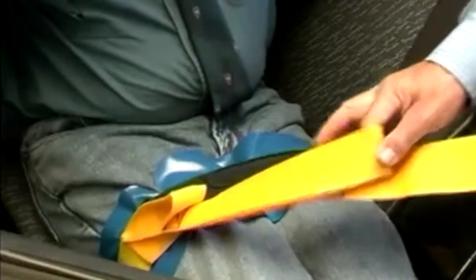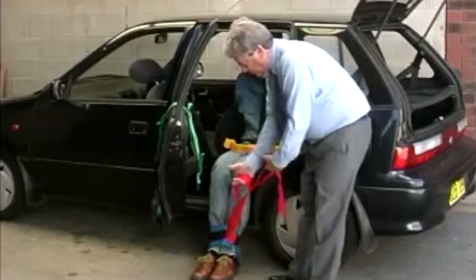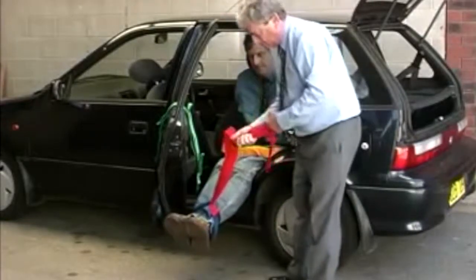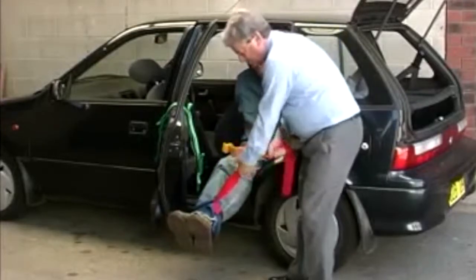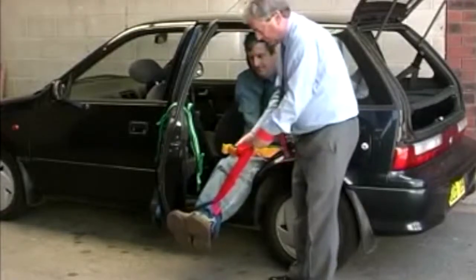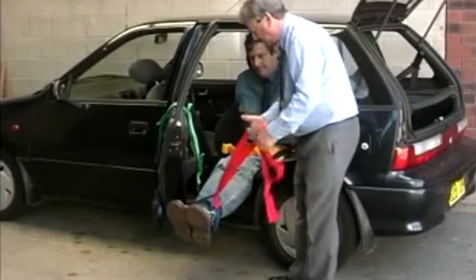When pulling on these straps, always use the loops that are provided. Do not hold with webbing. It is important to use the loops as your grip will not slip, as it may do if you simply grip the webbing. Never wrap the webbing around your hand, because if you need to release your grip in an emergency, you will not be able to do so. So always use the loops provided.